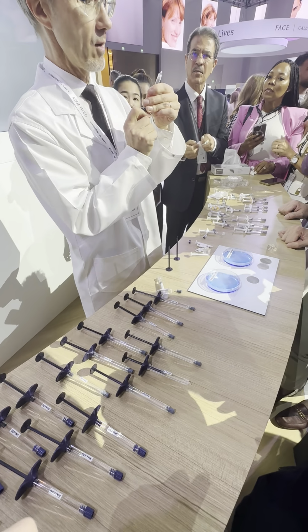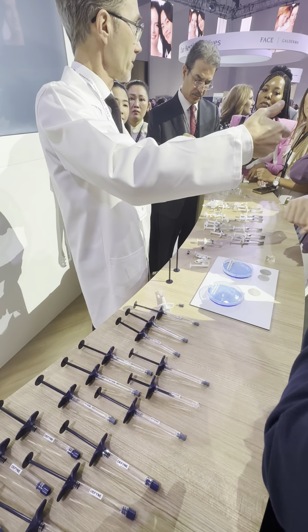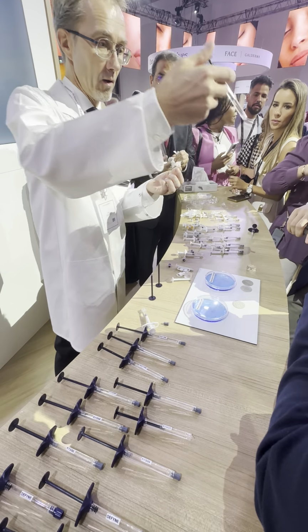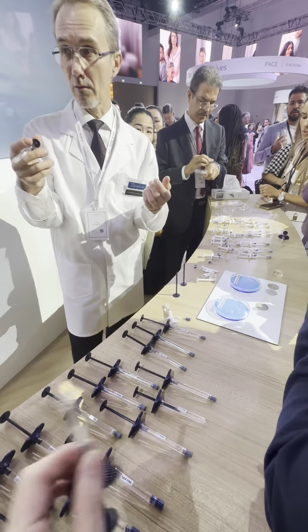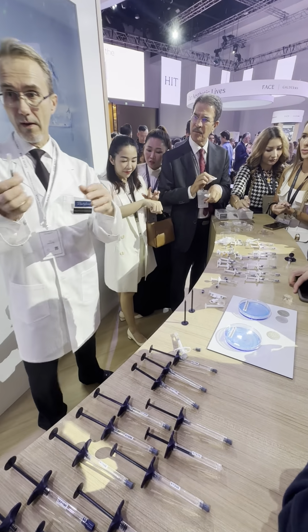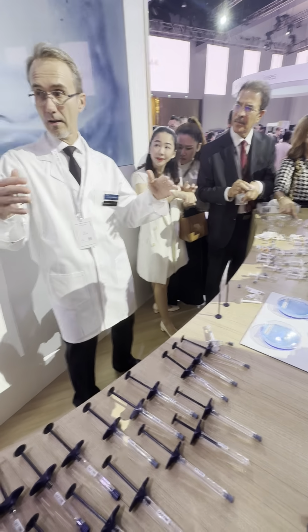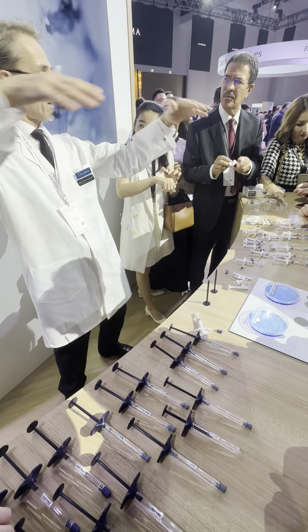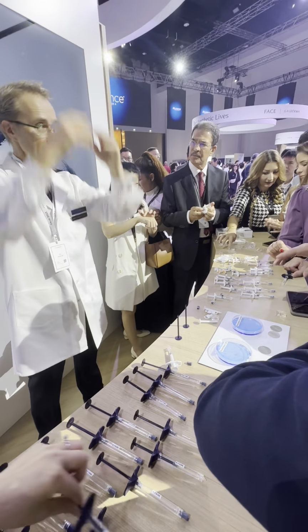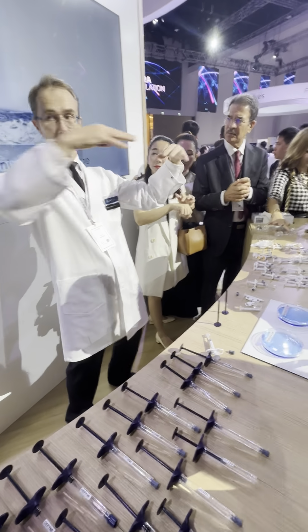Restylane Refine is a product with a very soft gel, very low G prime. In comparison to Restylane Lyft, very, very soft. This means when you have a very soft product like this, when you inject Restylane Refine, it will spread in the tissue. Restylane Lyft goes like this, and you get this projection. For this one, you get a much bigger integration of the product, so it spreads when you inject.